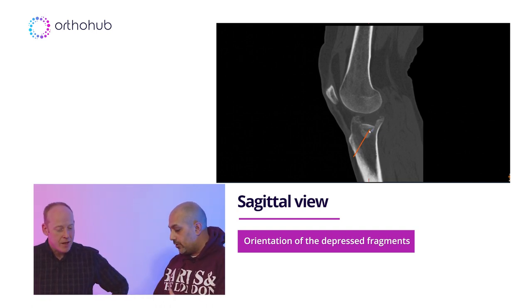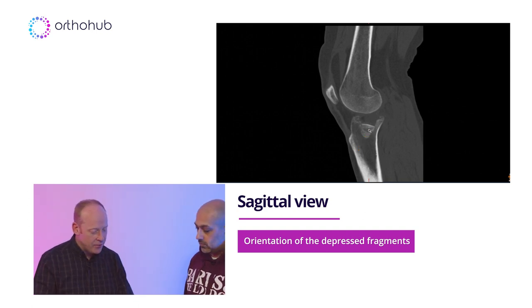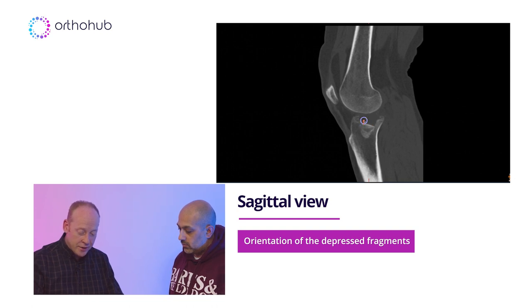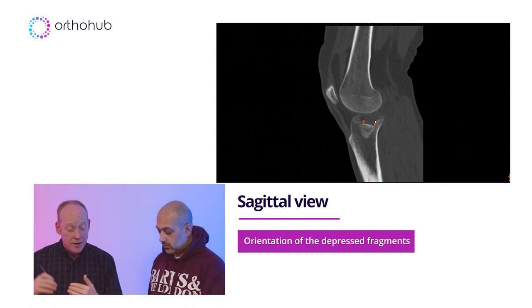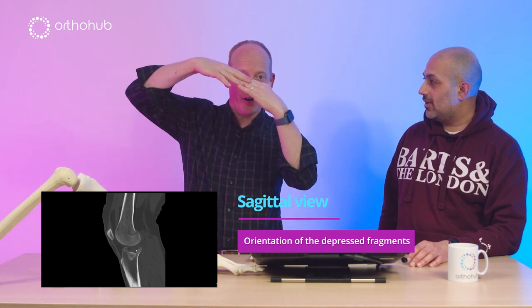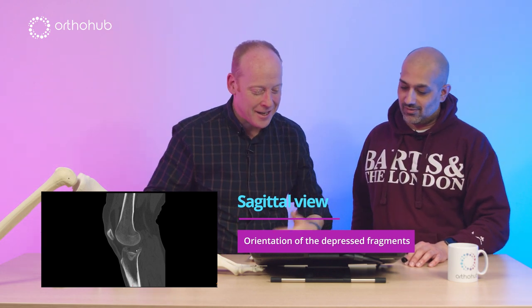Because you want to lift the back up, but you want to get the whole thing up, but otherwise you're still quite central. Otherwise, this will end up coming up front first, won't it? It'll come up on this side a bit more than this side. So you've got to bring it up, and when you're punching stuff up, what tends to happen is you punch it up and it kind of goes like this, and then you have to move your punch, and it goes until it comes through.